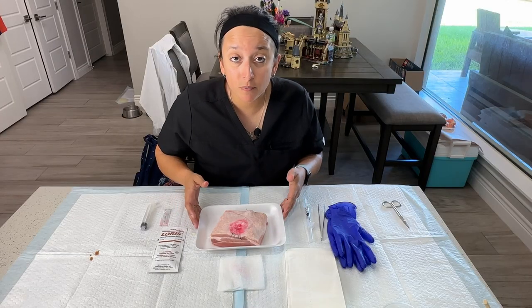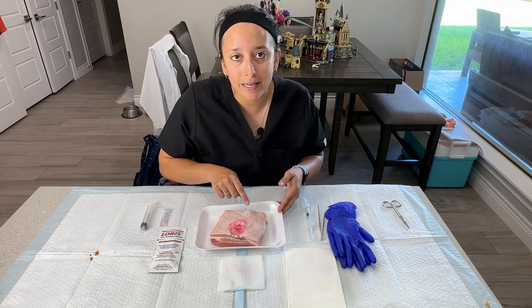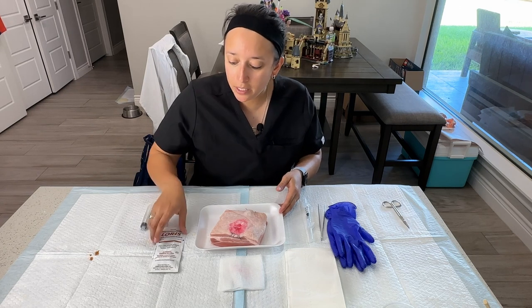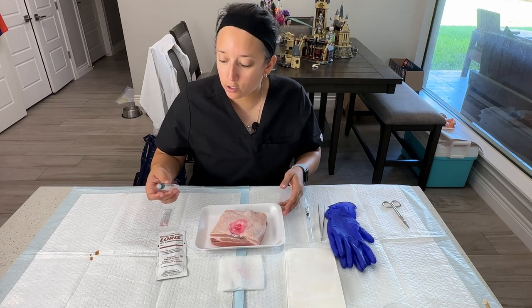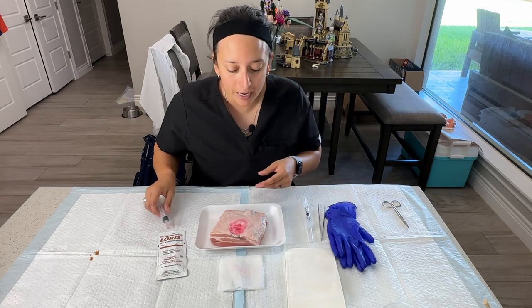The materials we're going to need for this procedure are our pig skin that already has the ganglion cyst buried under the skin. We're going to need something to cleanse the skin with, like iodine. We're going to need a syringe with probably an 18 gauge on it for aspirating.